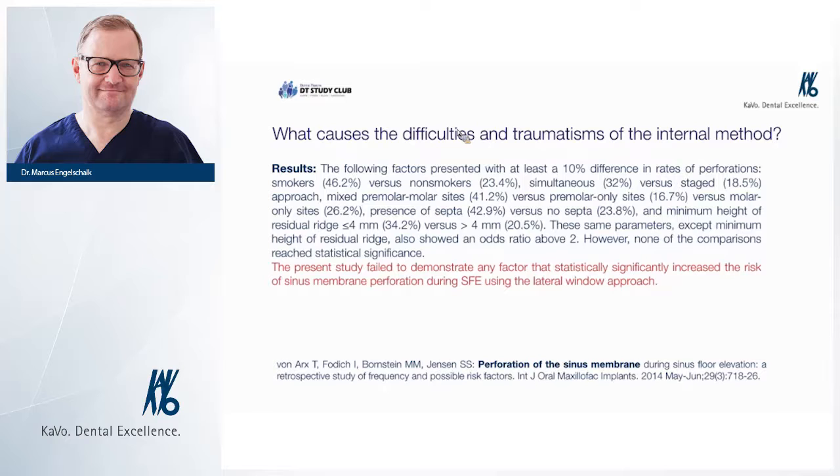Sometimes you won't see very well. I mentioned at the beginning of the lecture that for me it's very difficult sometimes at the mesial side, at the premolar side, just after you created your window, to open it, because you won't see there. You just have to feel with your elevation instrument if you are underneath the membrane or not.